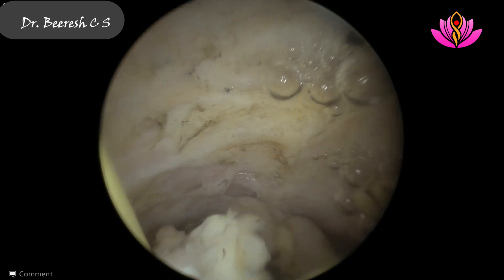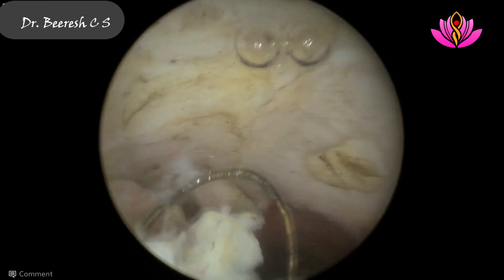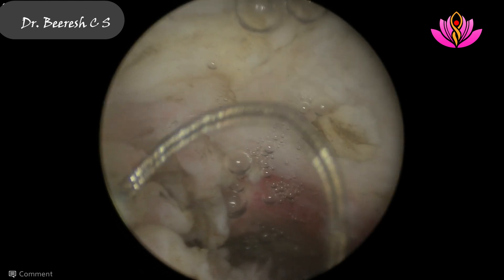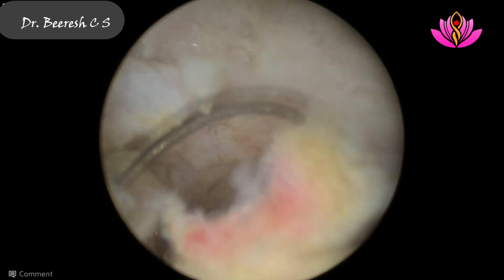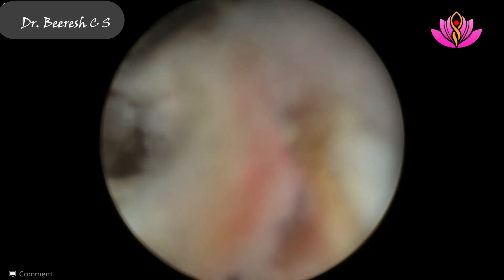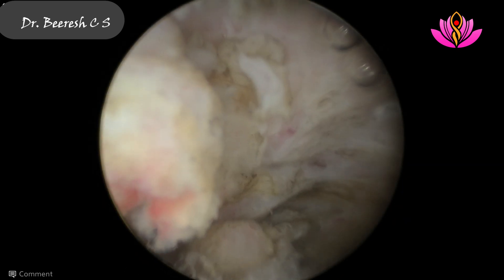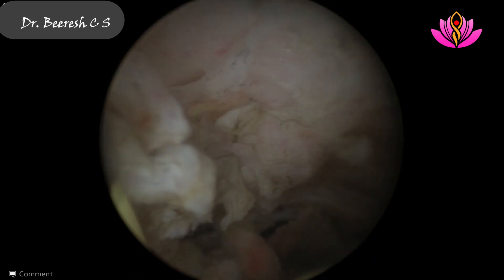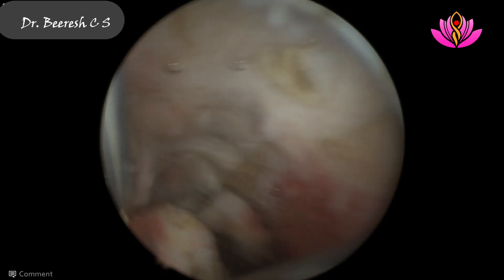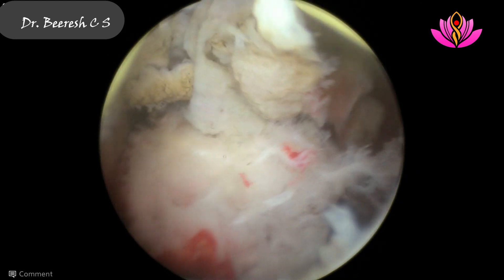What I am now attempting is scooping out the proximal ridge so as to flatten the isthmocel with the uterine cavity. I am doing this confidently because on scan I had confirmed that the residual myometrial thickness was good and the bladder was well away. The proximal ridge of the isthmocel is now flattened in line with the uterine cavity.